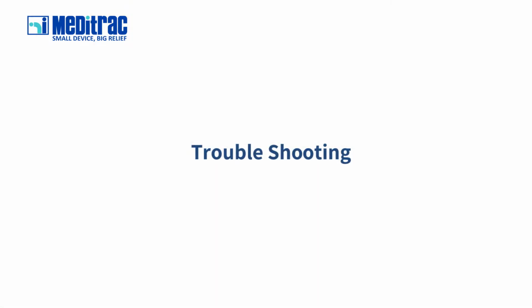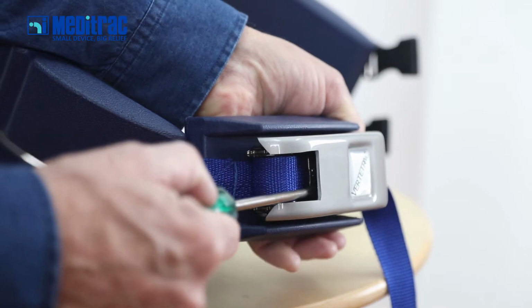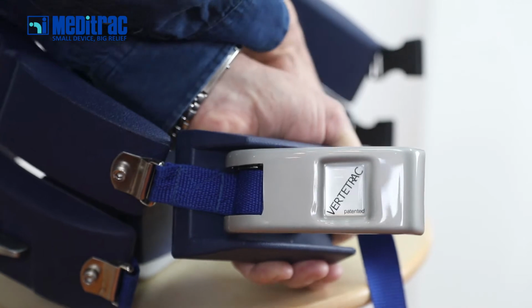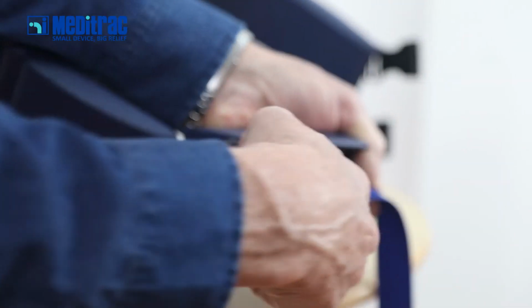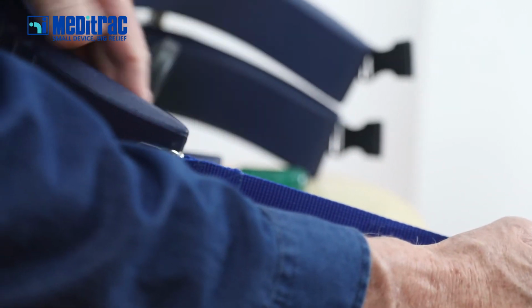When the ratchet was not fastened properly and is close to the buckle, use a long and narrow tool, screwdriver or dull knife, and push the metal plate against the spring. While pushing the metal plate, in U-shape inside, raise the plastic cover and release the belt.